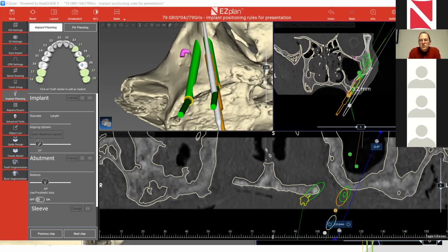Of course, we can do more, but in terms of FDA and regulation, I don't think we'll do that for these extreme cases. And from what I found out, after planning many cases, I didn't need more than 60 millimeters. So this is the answer for Michael Lees.